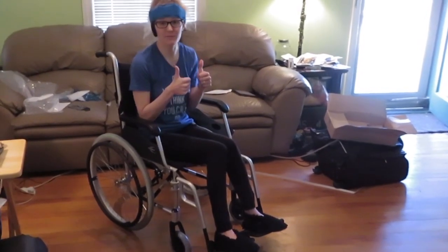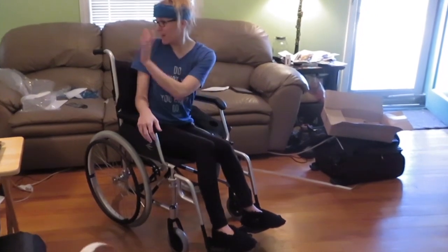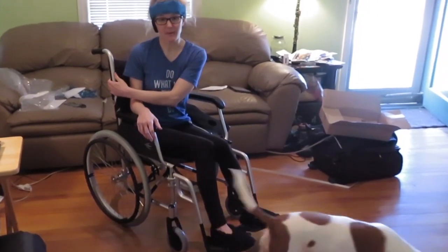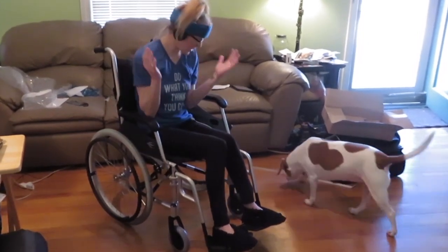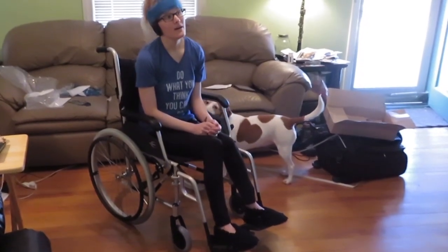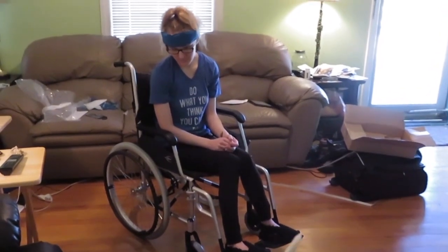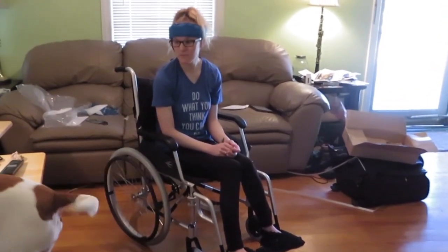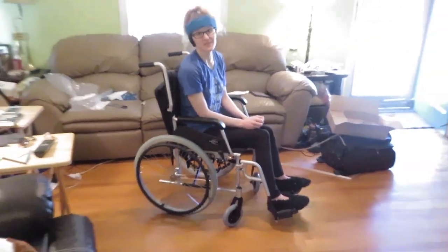Two thumbs up for the Karman LT-980. I really like that it folds down to make it super compact. I really like the strength of the brakes. I really like just the overall aesthetic of it. I'm a fan. It seems very sturdy. I really like the spokes on the tires — that little bicycle wheel look. I think that's pretty neat. Watch your fingers in them, I've heard.